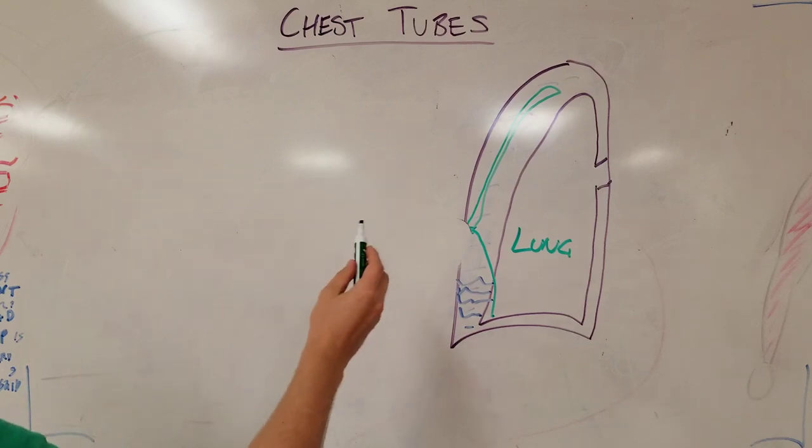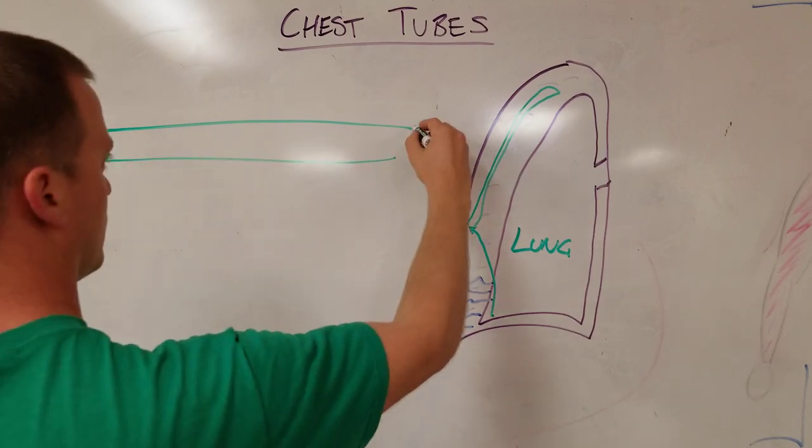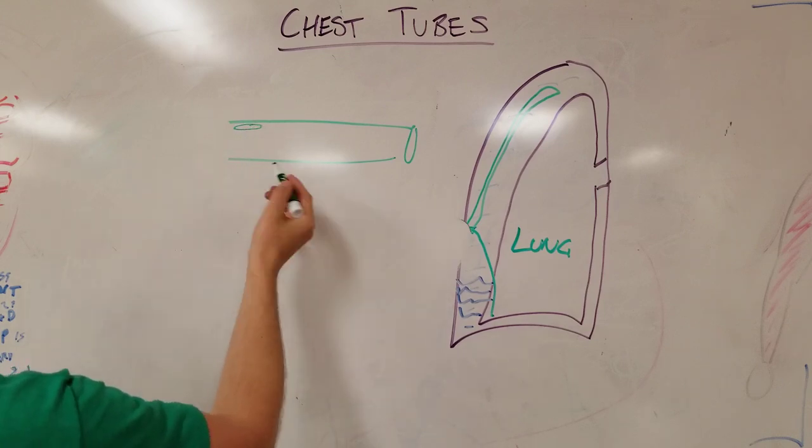How you know where your chest tube is is important, because if you look at your straight chest tube, let's say that this is the end of it and it goes on for a long period of time, you're gonna have one hole called the sentinel hole here. It's about 8 centimeters away from the end.